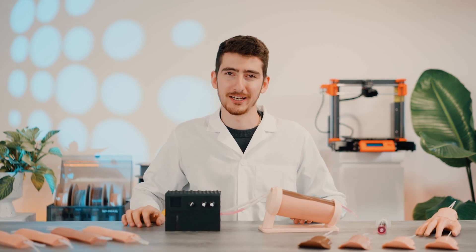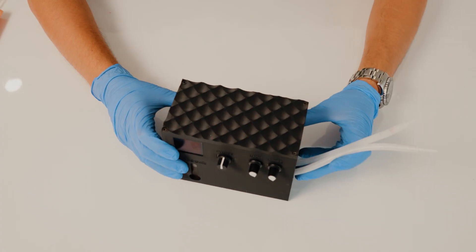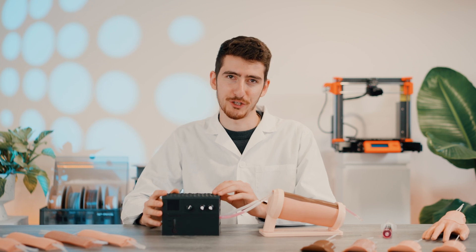My name is Artur, and I work at Proximity. I will show you how our blood circulation unit works. If you really want to enhance your learning, it is ideal to get real-time feedback. That is why we made a blood circulation unit.